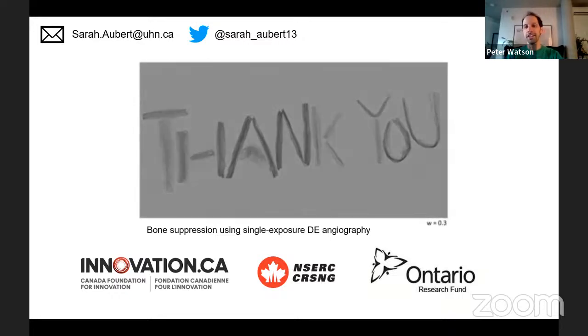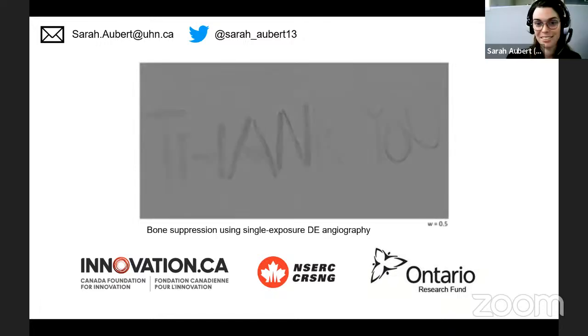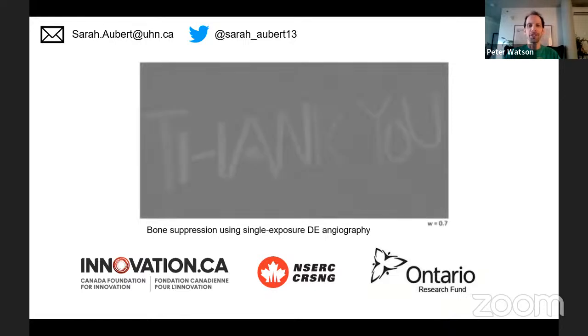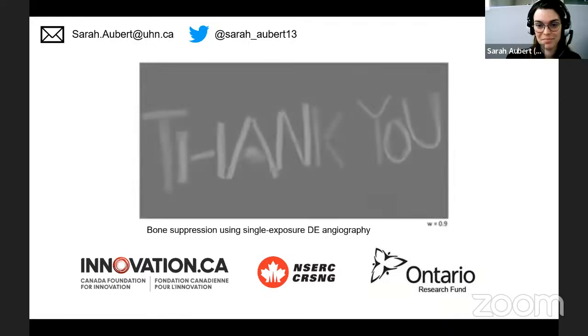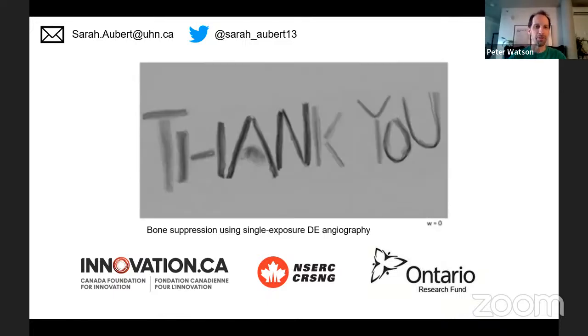And I guess clinically, it's always a high scatter condition because you're always putting the panel as close as you can to the patient. So I understand you did this for study purposes. But in practice, it's always going to be used in a very high scatter environment. So it's good to know how it performs.